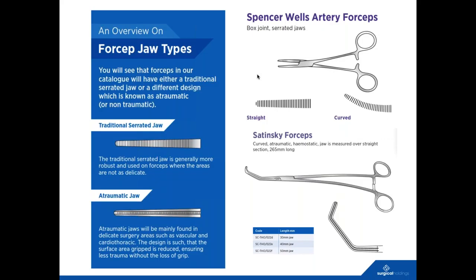So it is very important to realize this, because obviously if an instrument is being used on a very delicate artery, we wouldn't want the wrong clamp being used that is too coarse and could cause damage to that. So not only identifying that, but also checking for damage, because the atraumatic teeth are very fine, aren't they, across different instruments. They appear on, you know, DeBakey dissecting forceps and a variety of different clamps, DeBakey clamps as well.